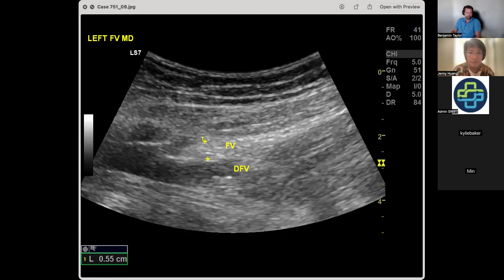Yes. Yeah. So what are the characteristics of thrombus normally? It's not compressible. Yes. Fills the lumen. Yep. The echogenicity changes over time. Yeah. And I can't remember if it's more hyperechoic acutely or more chronically. Okay. More chronically, it might get some reticulations within it. So some little recanalization. Yep. Okay. All right.